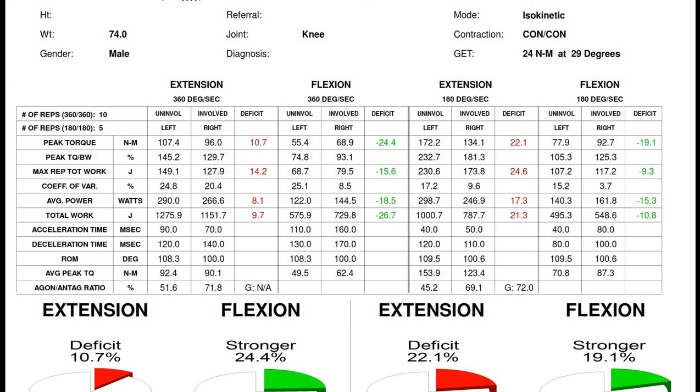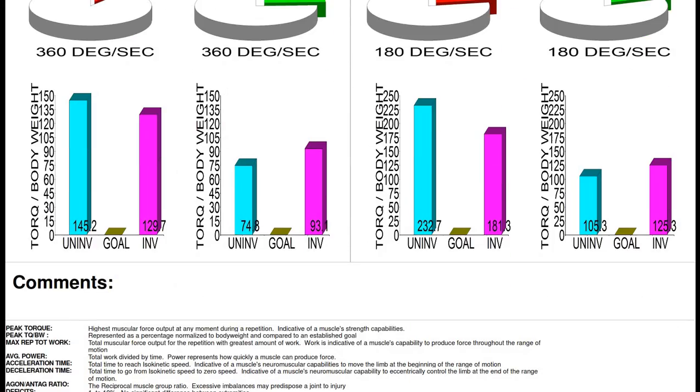If one of those isn't being used due to injury or is being avoided, then there is a greater demand placed on the other. So in this case, the agonist muscle would be our injured muscle, the quadriceps, or structures around where the quadriceps work.